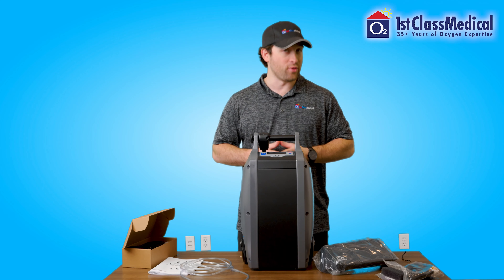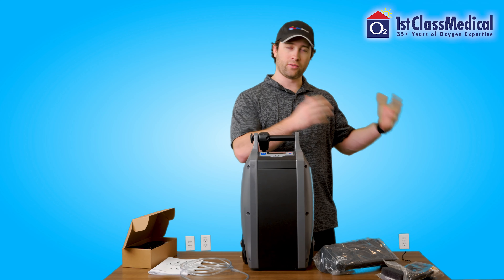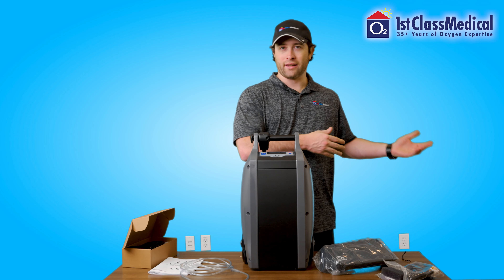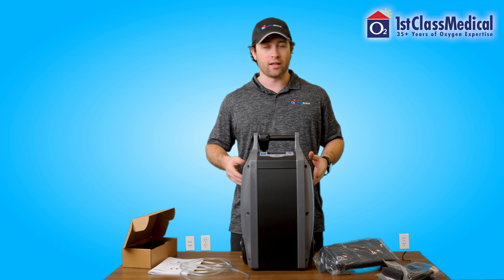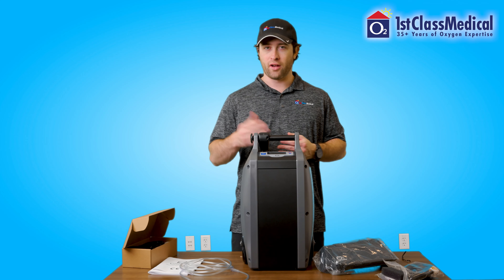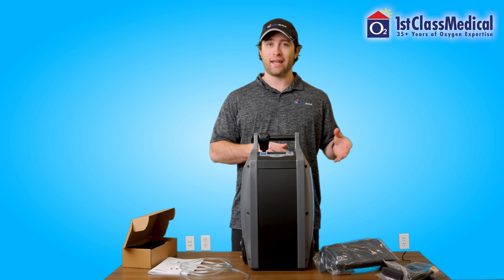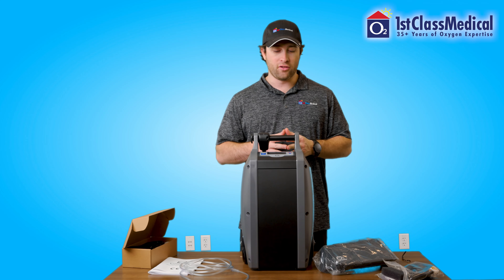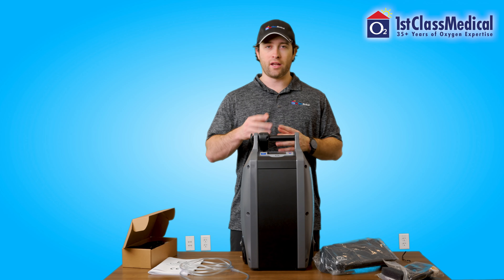The O2 Concepts OxLife Independence is great for those trying to get out and travel who need a continuous flow. You no longer need to travel with oxygen tanks for pulse flow and a separate home concentrator for continuous flow — this is your all-in-one unit. It can be used 24/7, 365. It can be used at night on continuous flow and during the day on pulse flow. Also, since it can do continuous flow at night, you can use this unit with a sleep apnea device such as a CPAP, BiPAP, or VPAP.